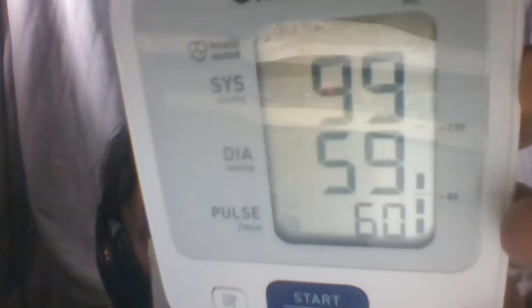Now it's giving some readings. It says systolic is 99, diastolic is 59, and pulse is 60. Apart from pulse, I'm not an expert. It's got an OK symbol — I think it does warn you if you've got some major problems. It can also store some of the settings.